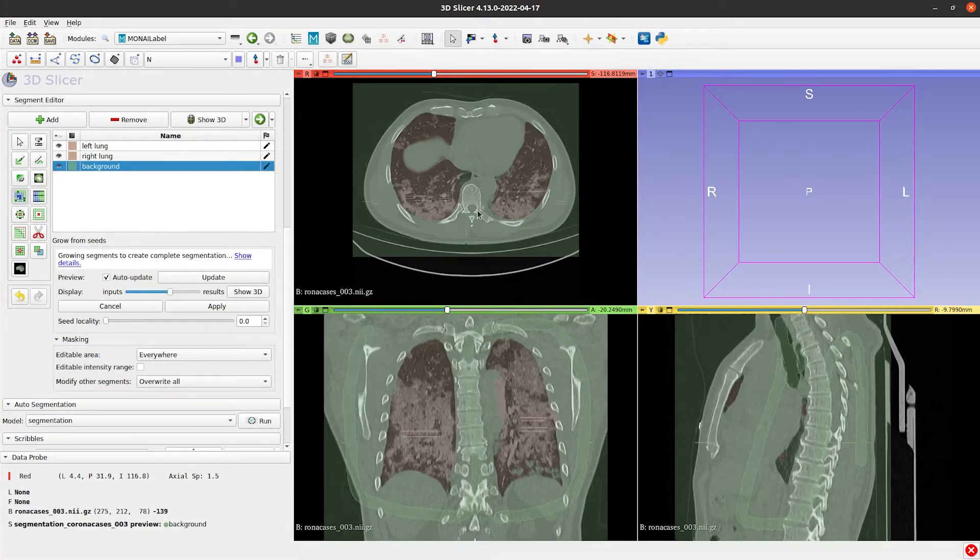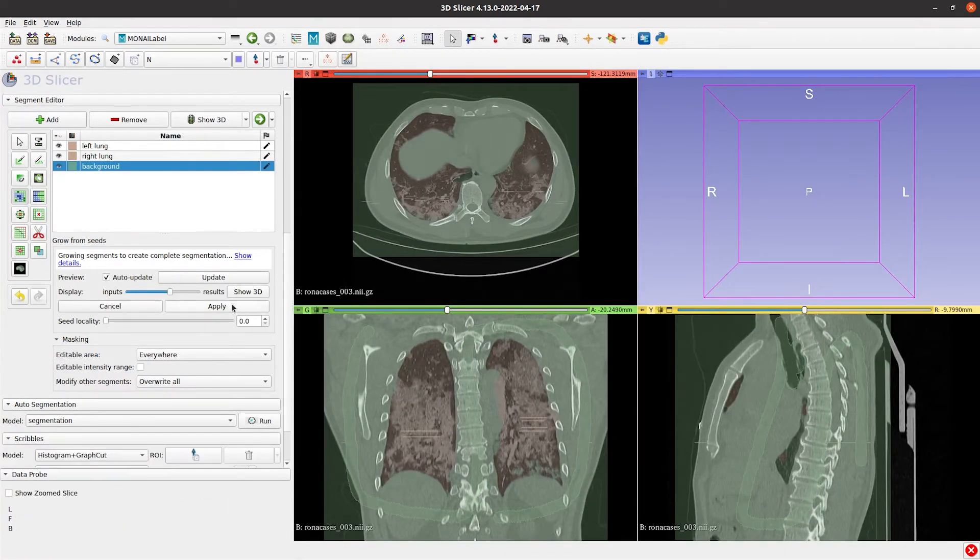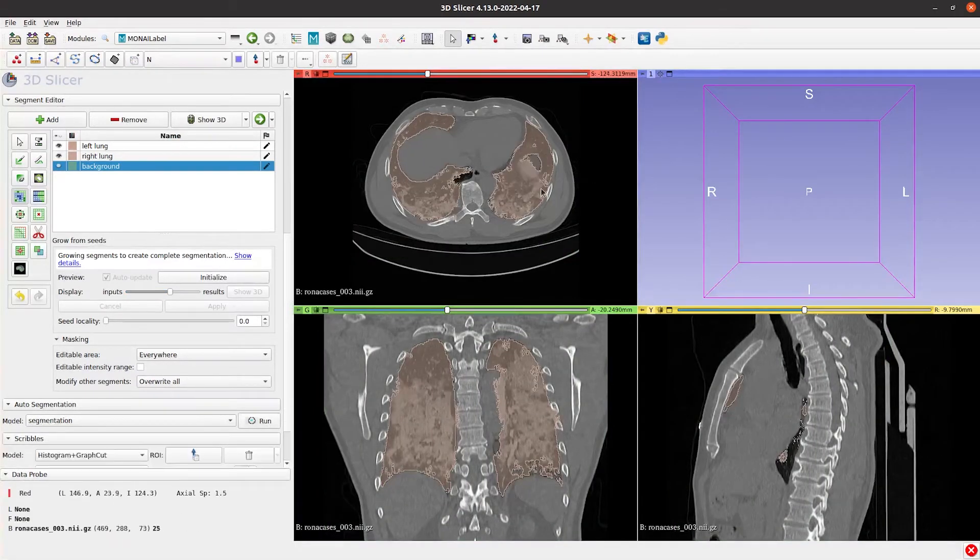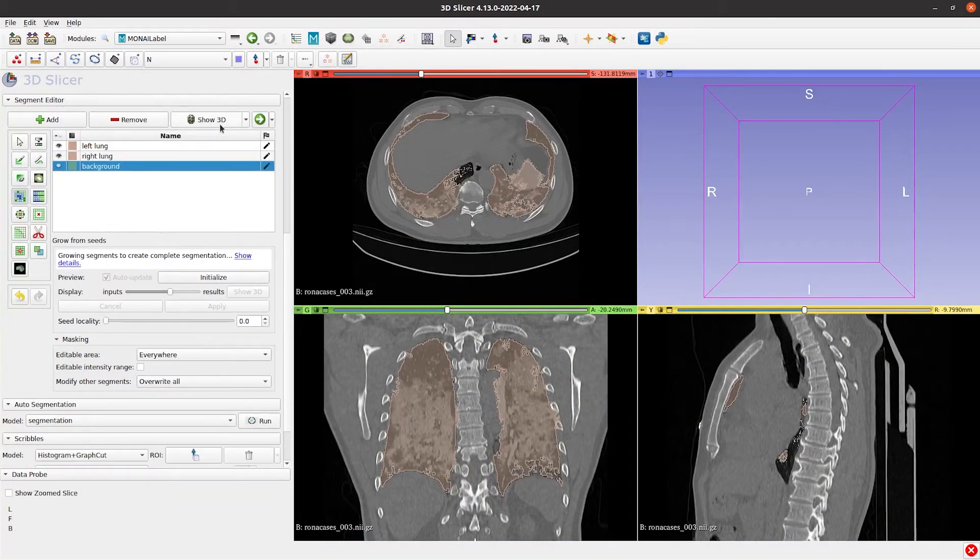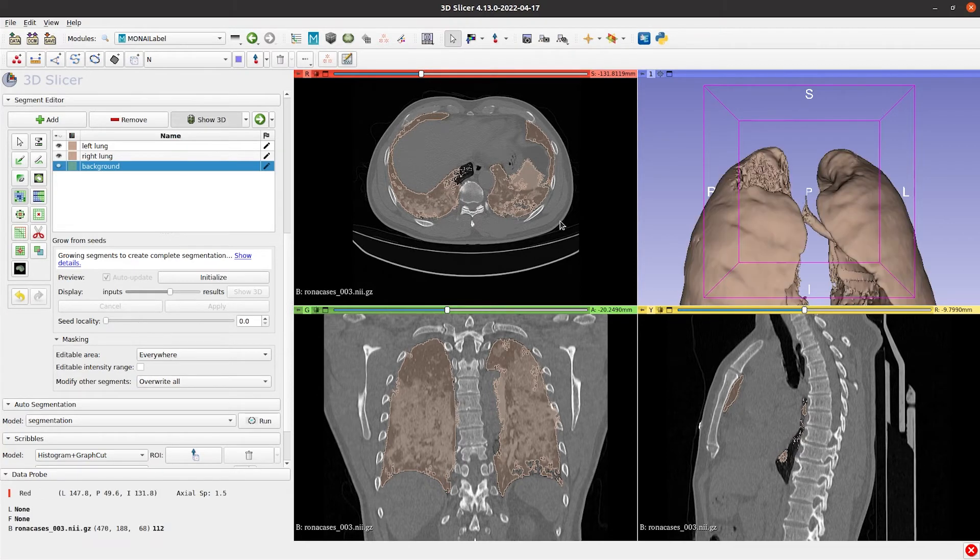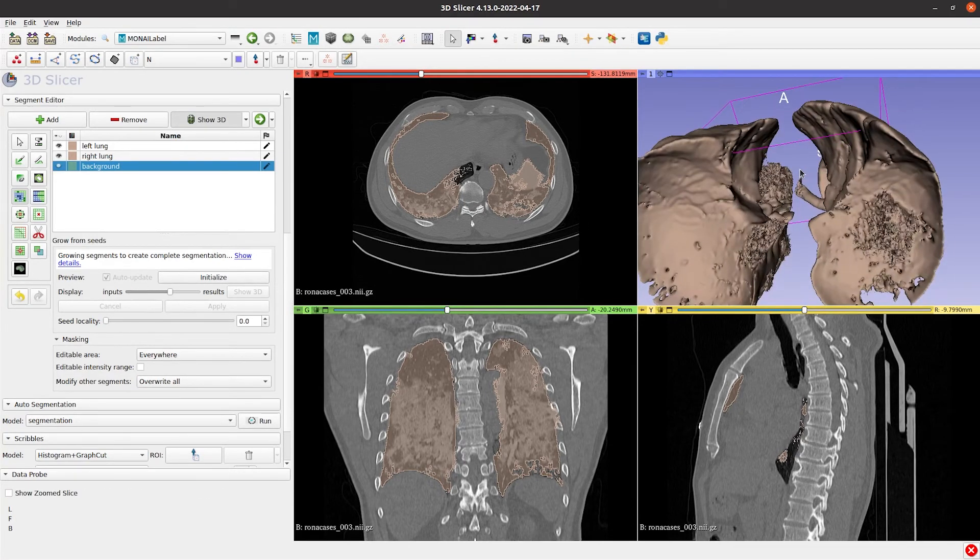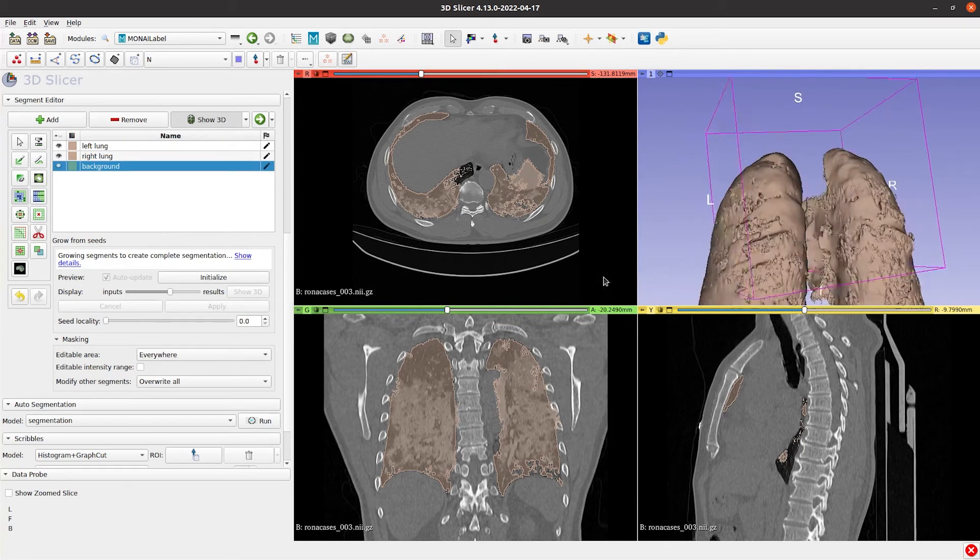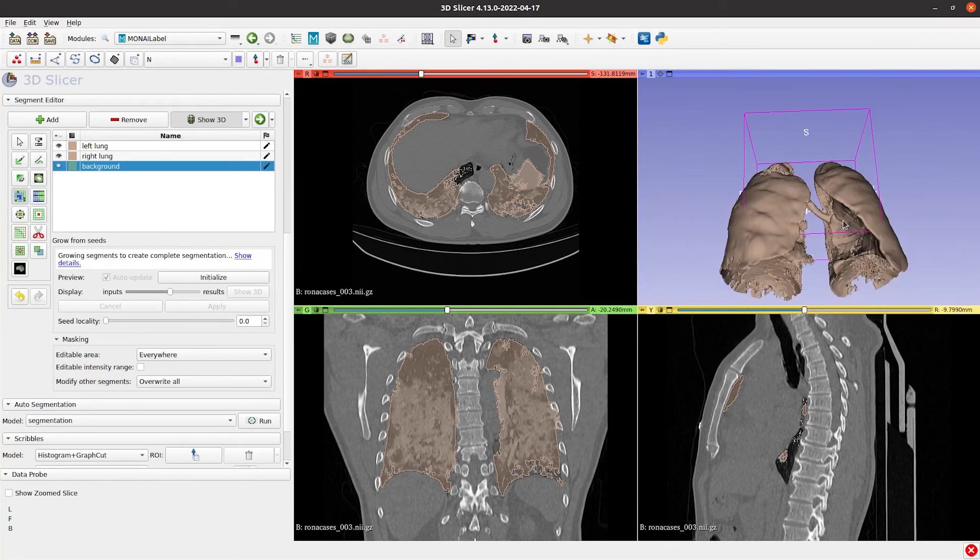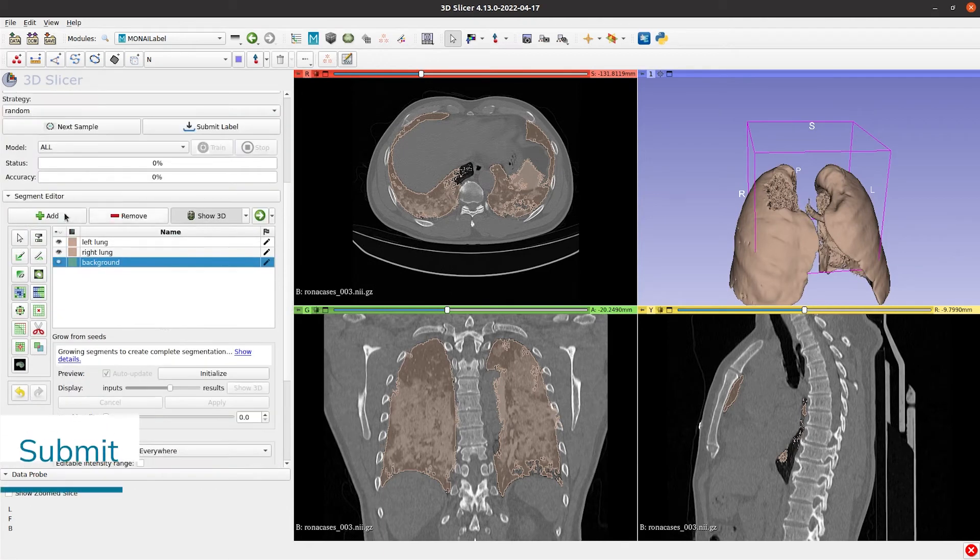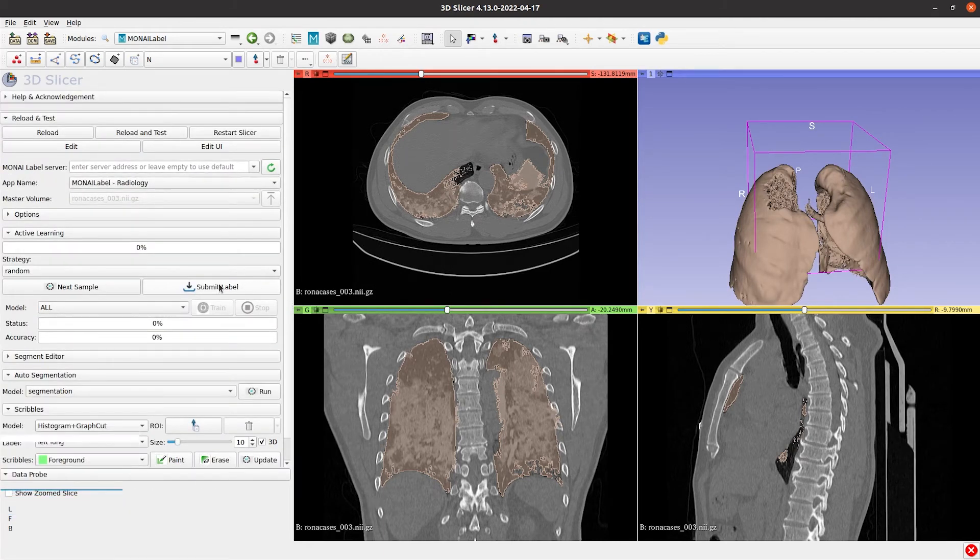If you are happy with the obtained Segmentation, click Apply, and then Show 3D. You can see that this label needs more work, but for the sake of this demo, let's say that this label is ready.